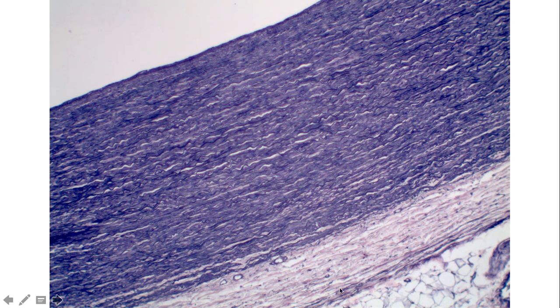And so in this slide here, this layer that I'm highlighting, this is going to be the tunica externa. Again, this is going to be a CT, kind of fibrous, also loose areolar CT layer. Now, something that we can see in this field of view, which is going to be associated with these large veins and arteries, is going to be these three little vessels right here. And so the largest of our arteries and veins, in this case the aorta, they require their own vessels. And so these are the vessels of vessels, and this is referred to as the vasa vasorum.